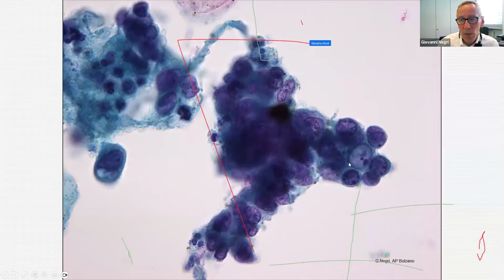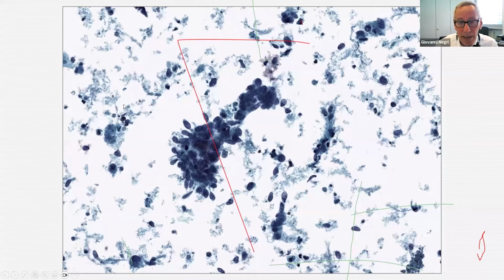Early infiltrating adenocarcinoma begins to be evident when you see a higher atypicality, maybe rounded nuclei, maybe macronucleoli, but most important, you see isolated tumor cells. You remember in normal epithelia, reactive epithelia, in adenocarcinoma in situ, you usually have sheets, no isolated cells or a very low number of isolated cells, and of course, no tumor diathesis. When the neoplasia is obvious, then you may see that.